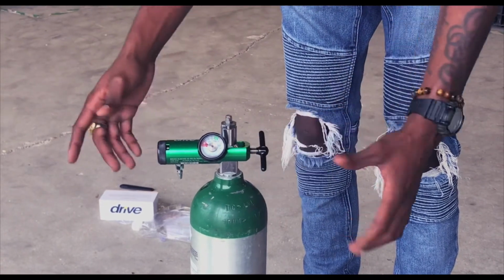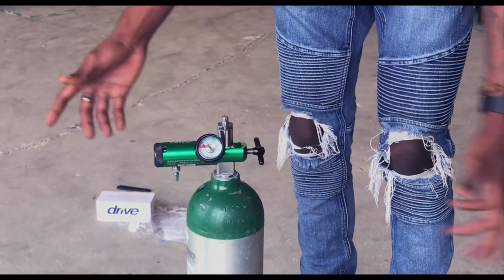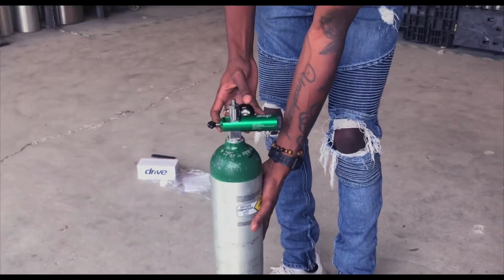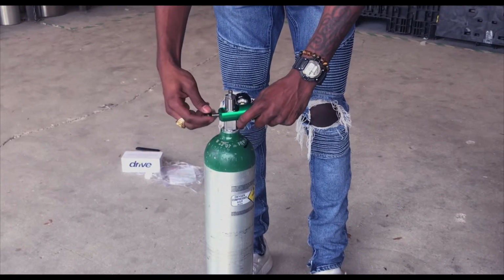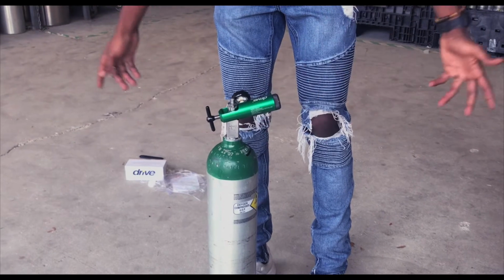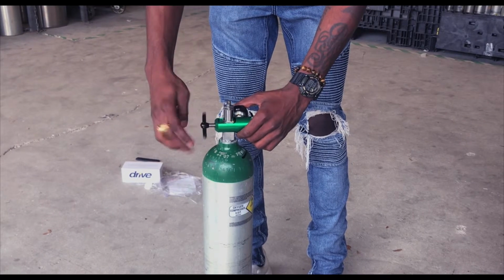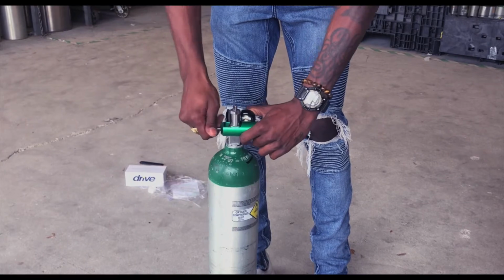You don't want to go too tight, and you don't want to have it too loose. So right there, I have the regulator on, it's snug, it's not leaning. Sometimes I'll come to a patient's house and they'll have the regulator like this. This is not correct. You want to make sure that your regulator is nice and straight, nice and even, so you get the best oxygen possible.